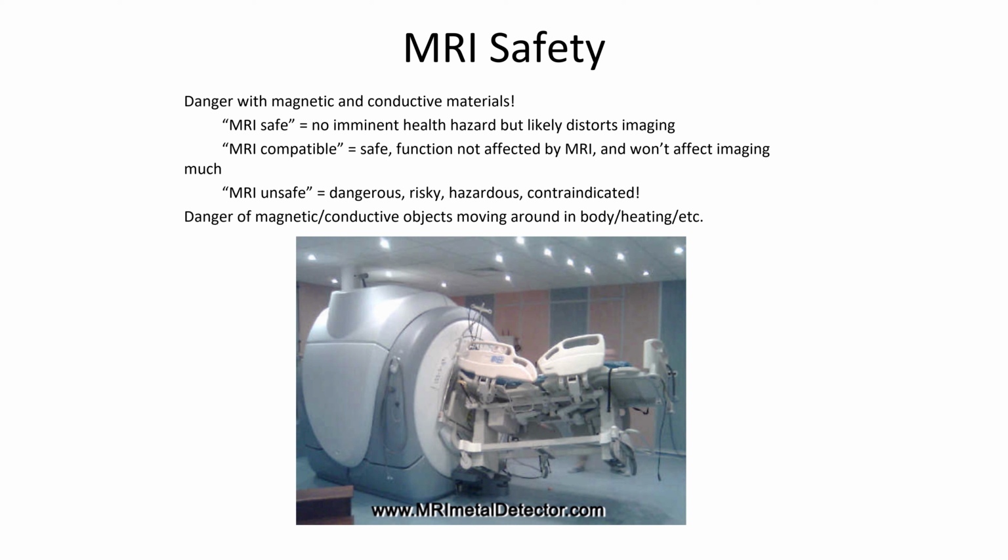Another point that's important to cover is MRI safety. So obviously, whenever you go into an MRI room, you have to be super safe about what you have on you. You don't want anything magnetic at all: belt buckles, pens, other things. And with patients, this is especially important. This picture shows someone who wheeled a bed into the MRI room, and of course the bed got sucked into the MRI machine. Same thing with anesthesia equipment.